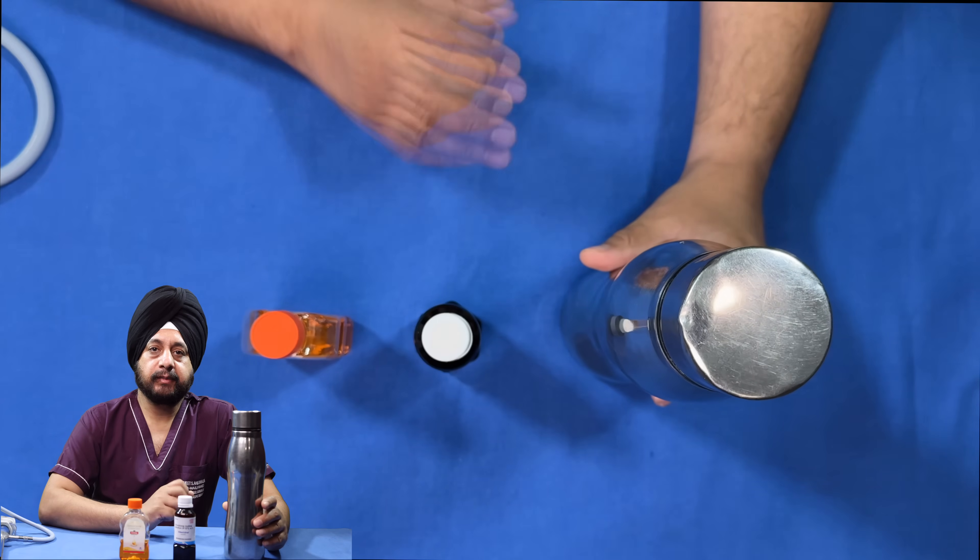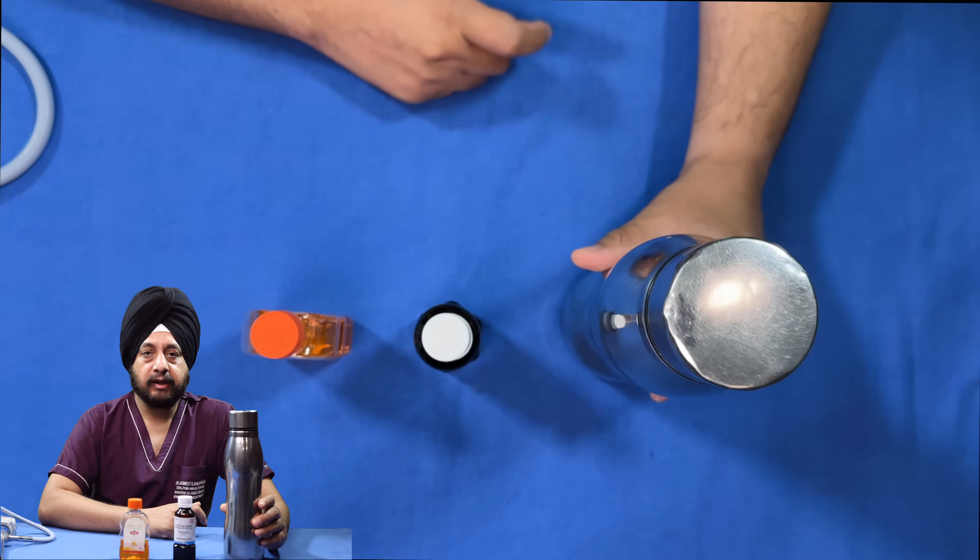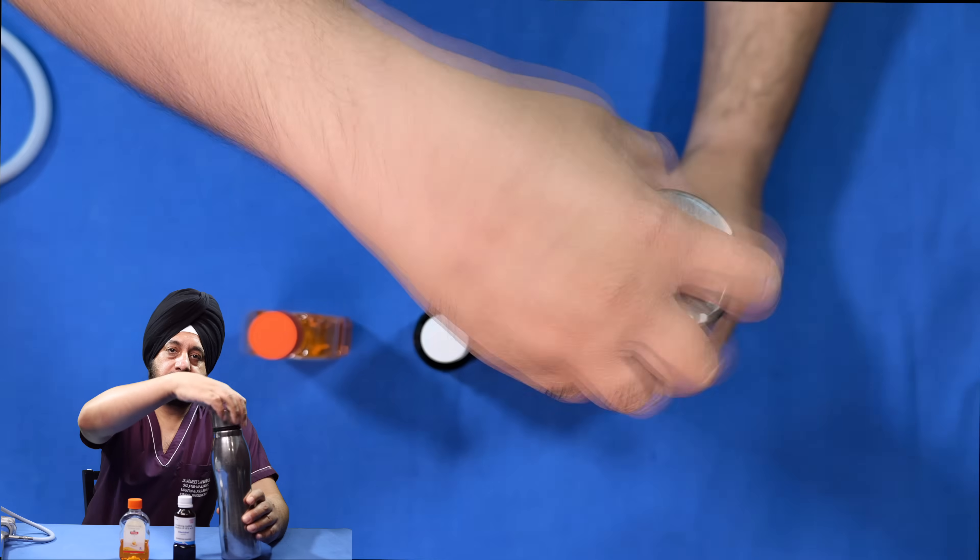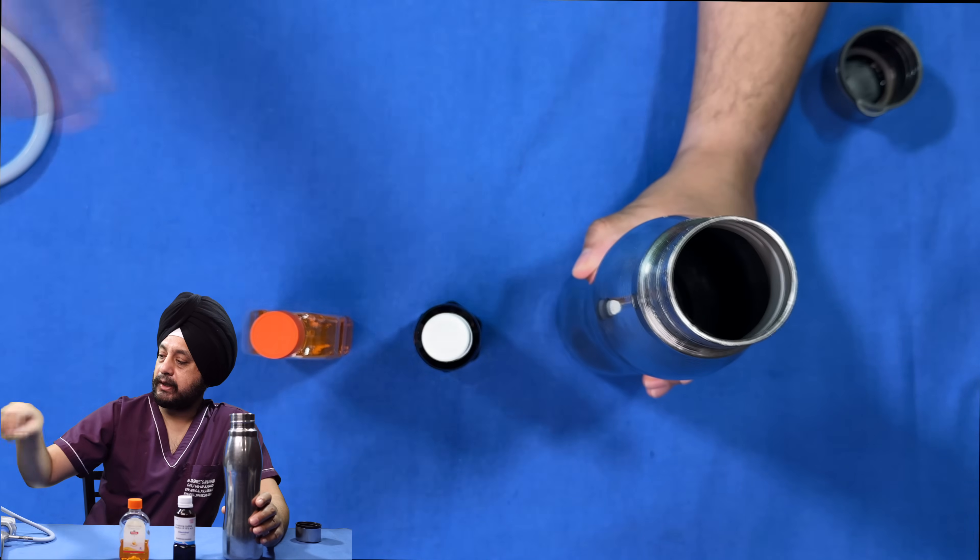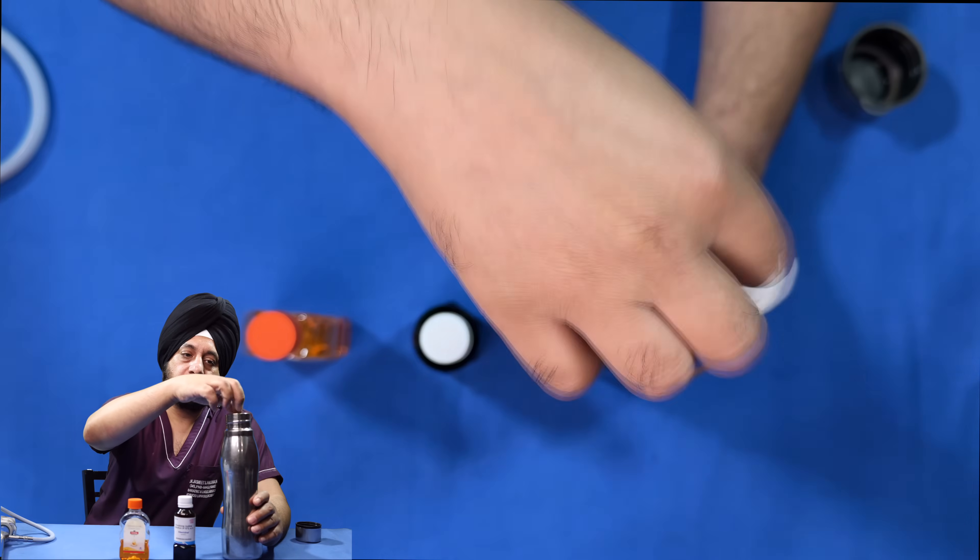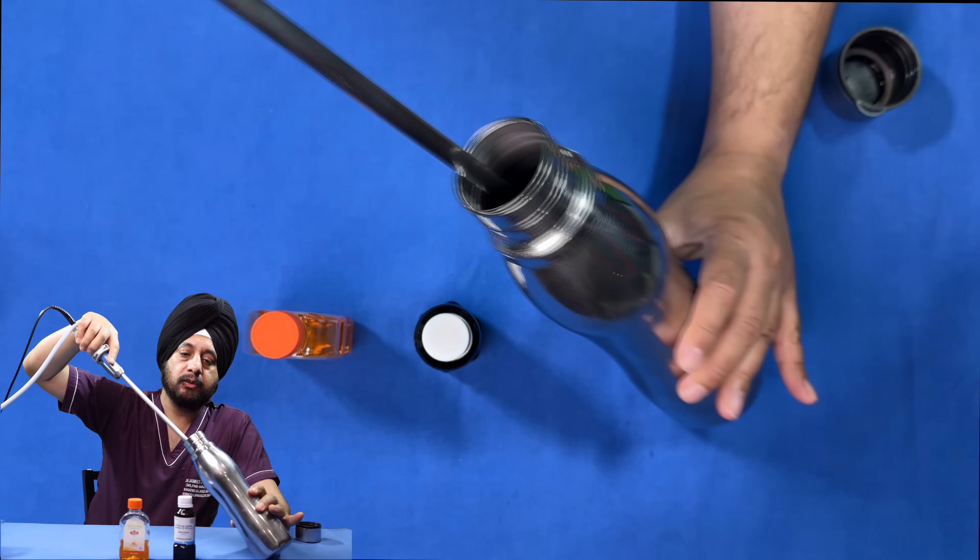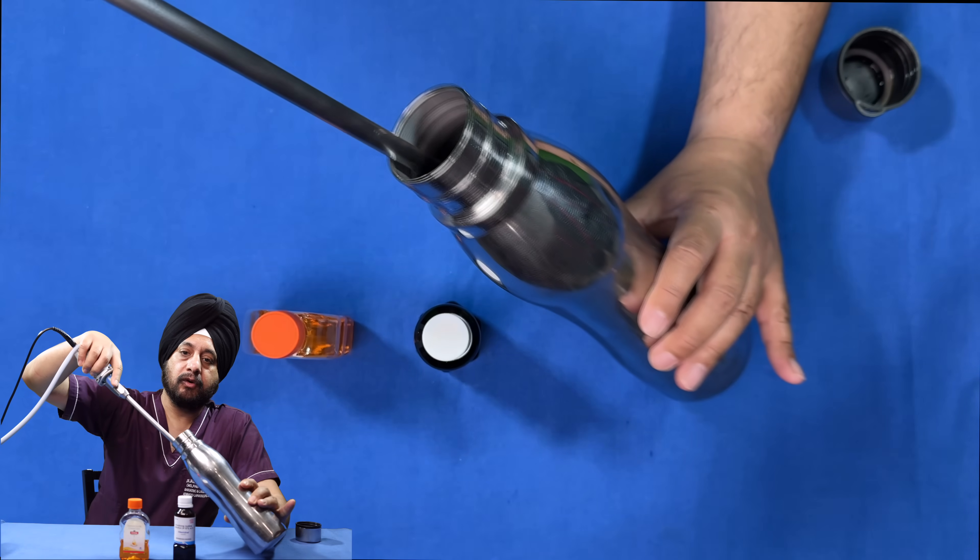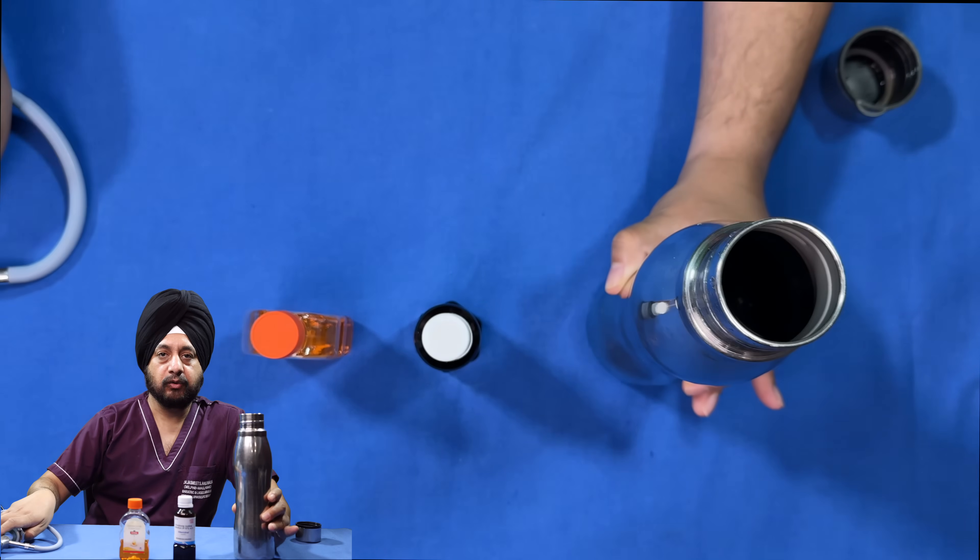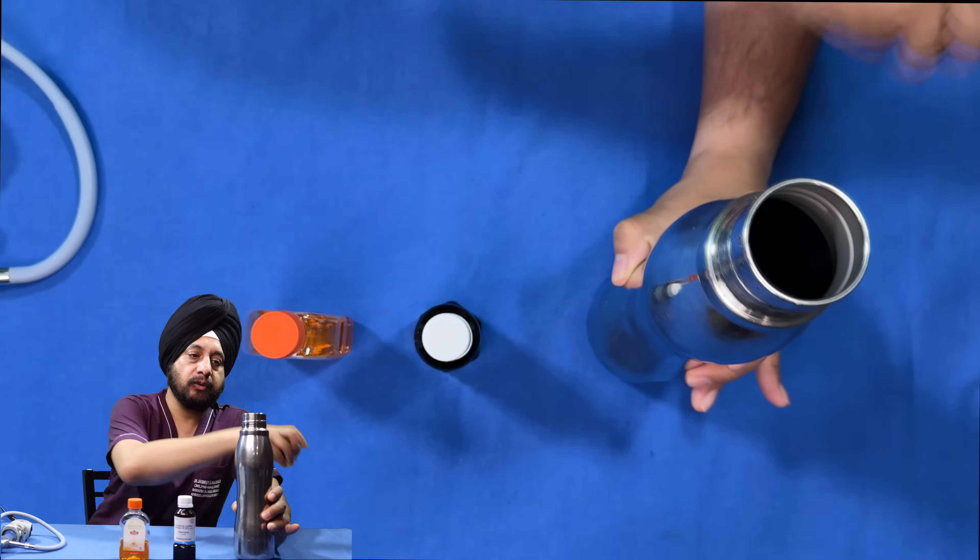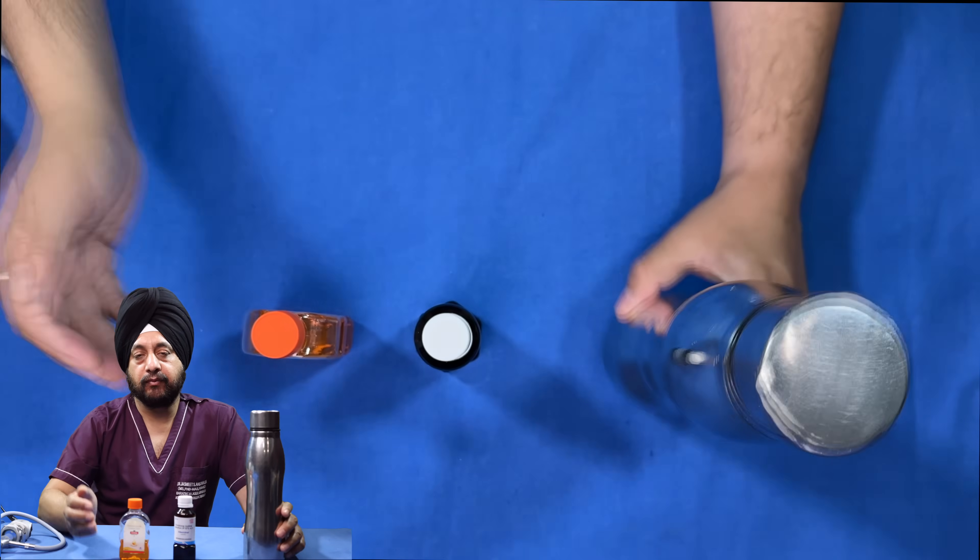To decrease fogging during surgery at the tip of the scope, we can use various methods like this one: a flask filled with hot saline. Always keep a gauze piece or pad at the bottom so that when you're inserting your scope, it doesn't hit the bottom. Only then insert the scope into the lukewarm or slightly hotter saline. How long do you dip it? That depends on the room temperature and OR conditions. With time you'll know you need to dip it anywhere between 5 to 30 seconds.